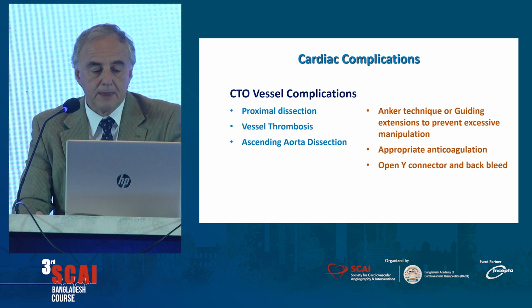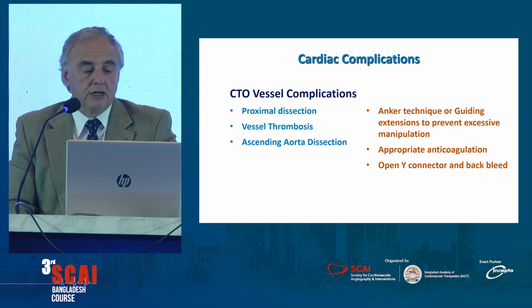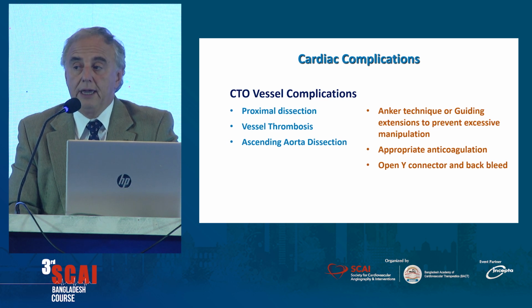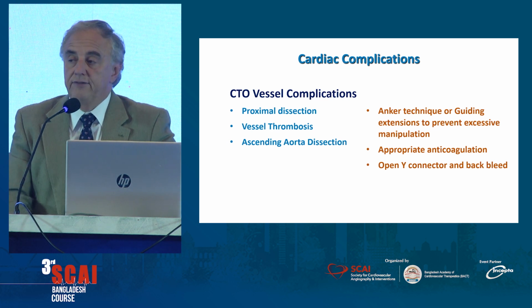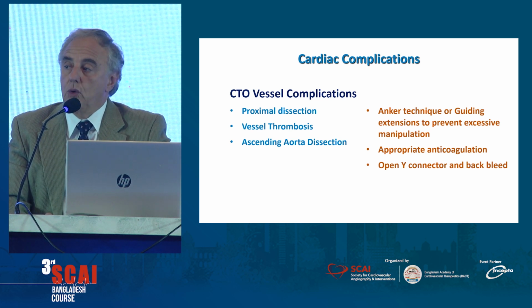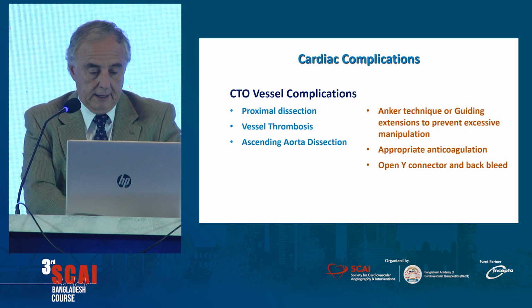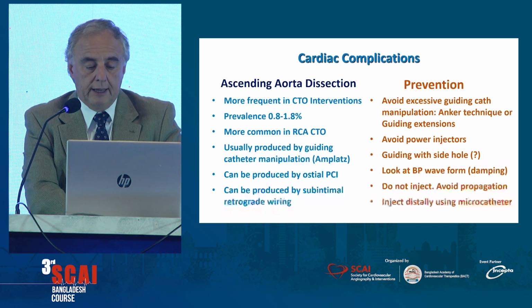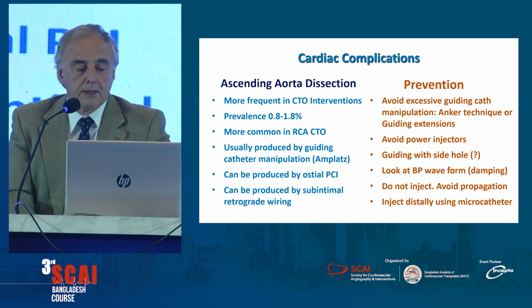The CTO vessel complications are kind of similar problems: proximal dissection, vessel thrombosis, and ascending aorta dissection. Anchor technique and guiding extension may help to prevent this excessive guiding catheter manipulation. And again, appropriate anticoagulation, as Dr. Kim showed you, is very important. Again, open the Y connector.